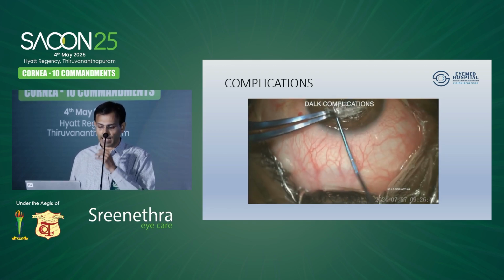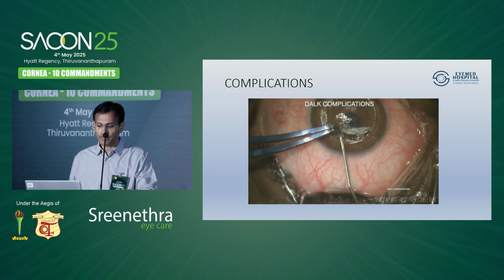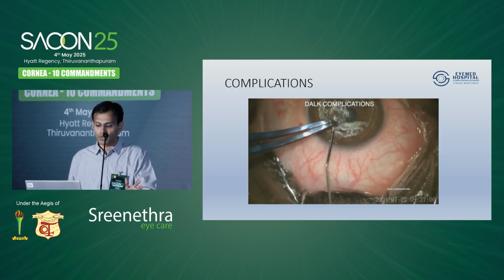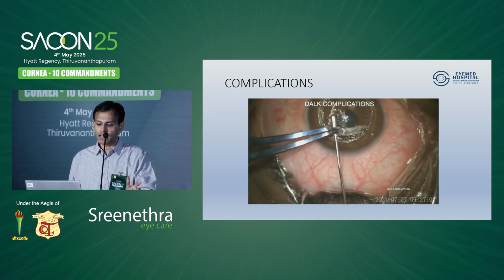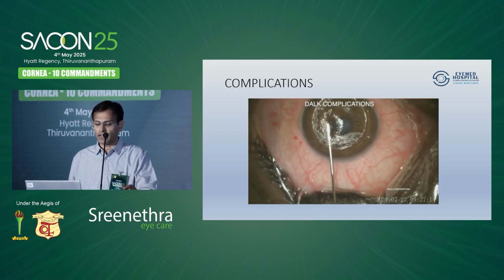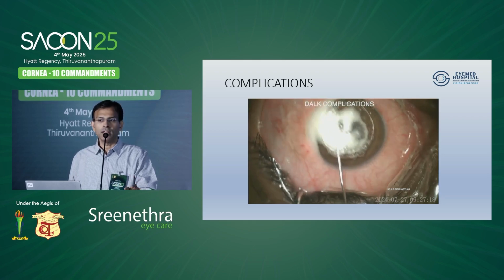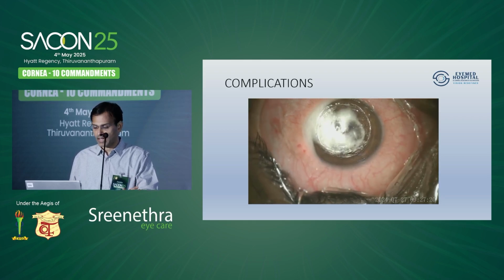So if it happens, you can go to the next side here, again do the tunnel carefully, and you can go with a bubble. So you have to be very, very gentle and very careful. And even after 45 minutes of entire dissection, you have to be careful that at any time perforation can occur.